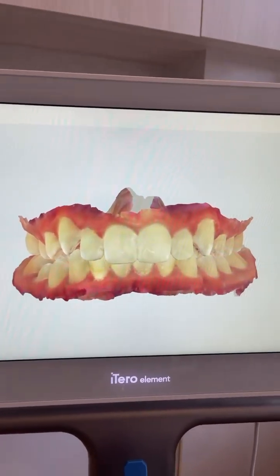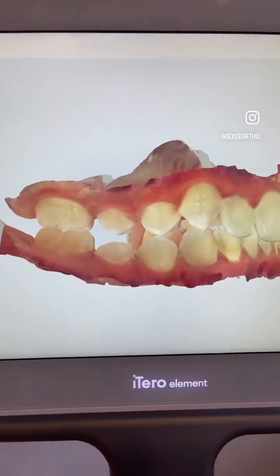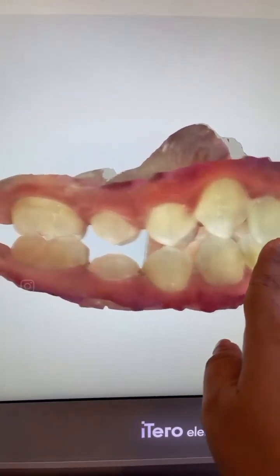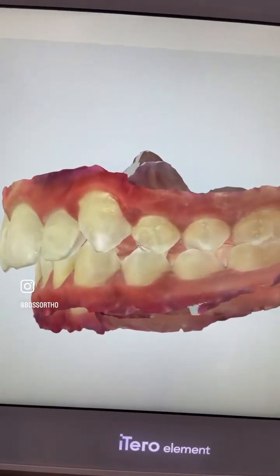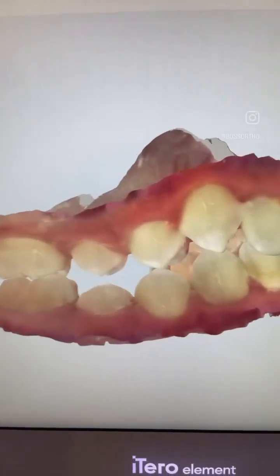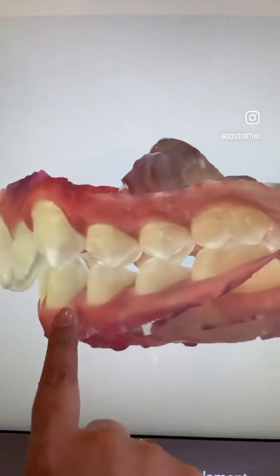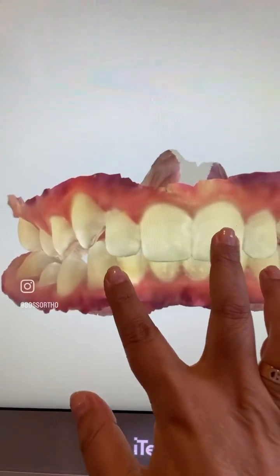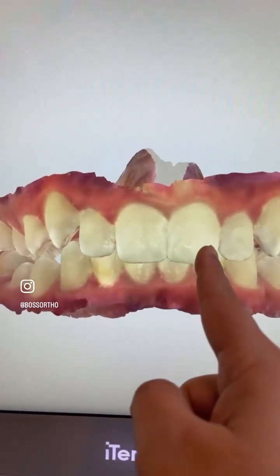As you can see, we still have some deep bite, and we had some delayed eruption, but we're getting the 4-5, 1-5 erupting, which is kind of nice. On this side the eruption is a lot better, but we've got mild deep bite, mild overjet. We've got a class 2 canine on one side and a molar, and still a half unit class 2 here as well, with some midline asymmetry. You can see the lower midline here shifted from the upper.